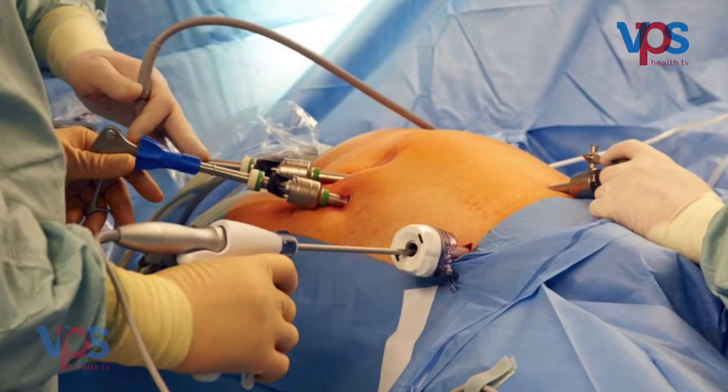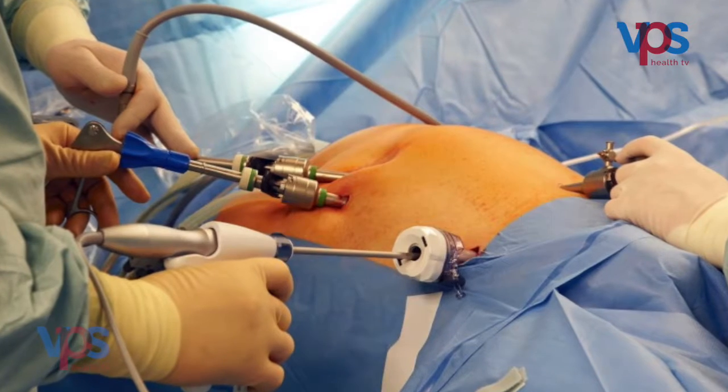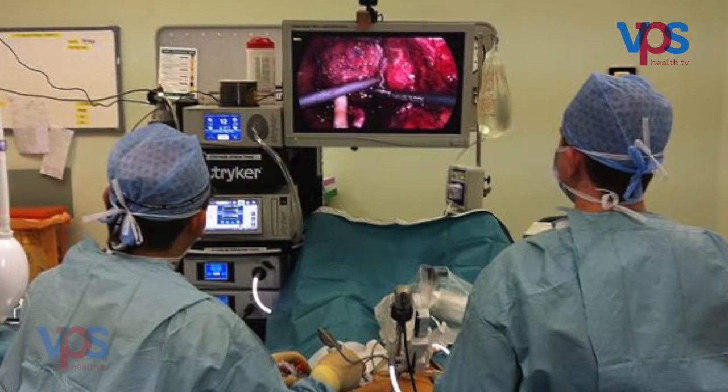With the introduction of minimally invasive surgery, the prime intention is to reduce the morbidity of the patient. We need not cut open — we introduce certain instruments into the abdominal cavity, and a telescope is introduced through which you can see everything through a large monitor, magnified.